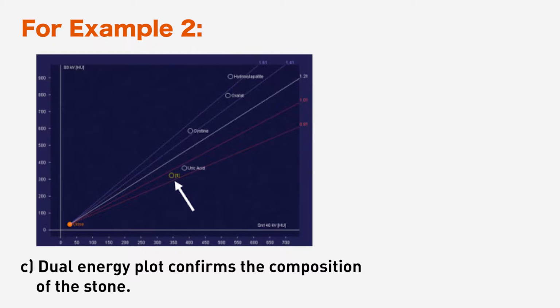The ability of CT allows doctors to identify the composition of stones, which offers the potential for treating physicians to customize therapy based on the crystalline composition.